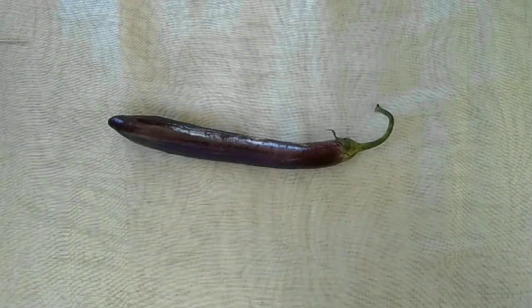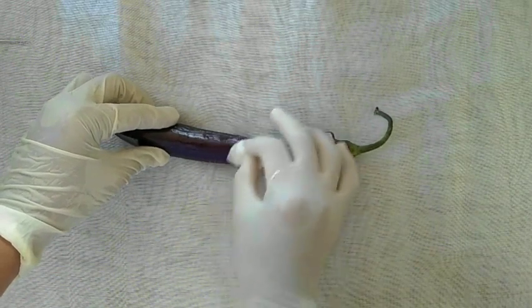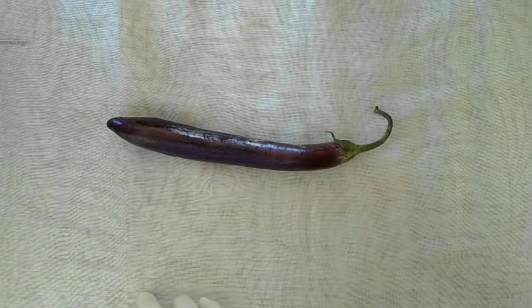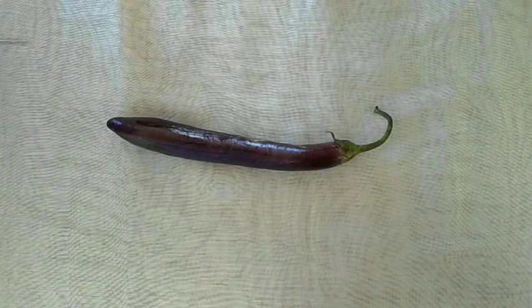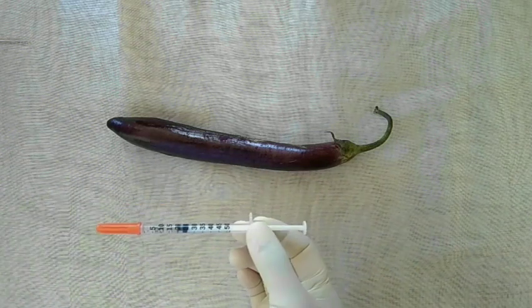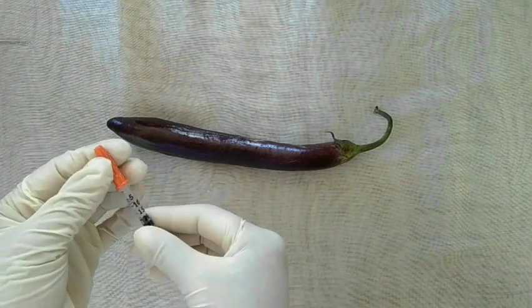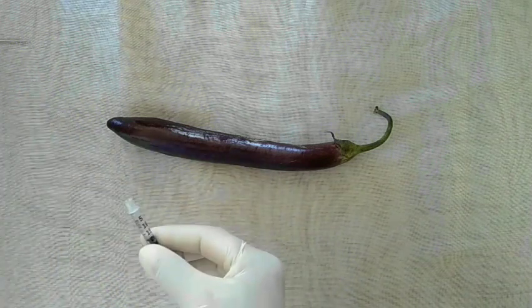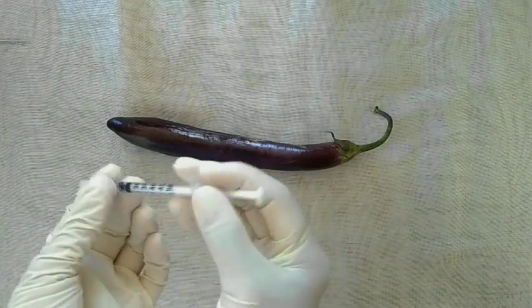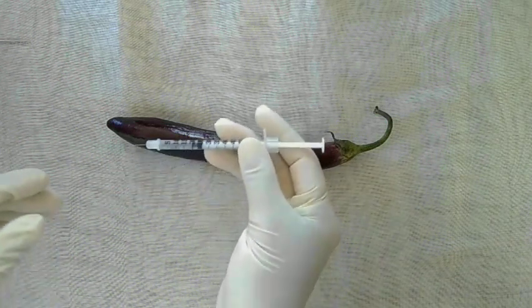Then clean the selected site using an antiseptic swab, starting from the center, going outwards. Then we'll have to prepare our syringe for injection while waiting for the selected site to dry. Then uncap the syringe. Now pinch the skin. Hold the syringe as if you're holding a dart. And then inject the medication into the patient.